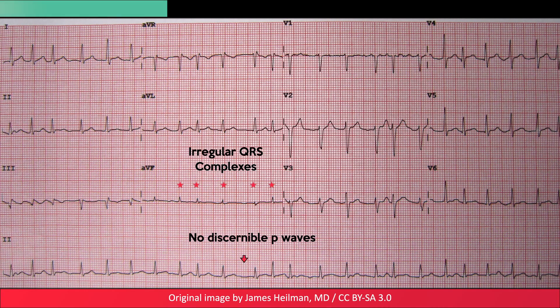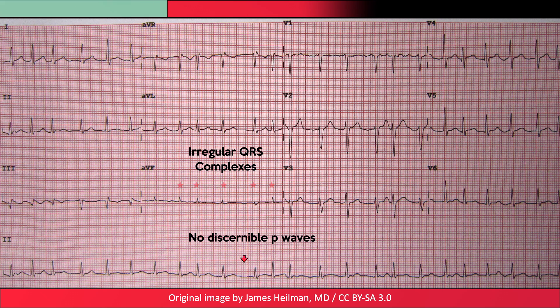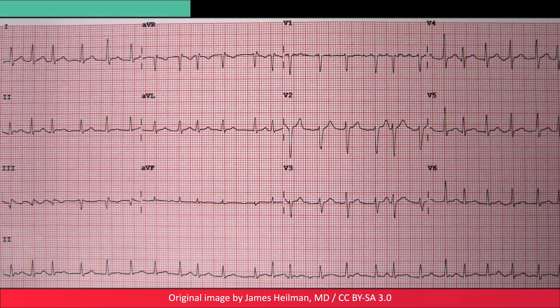When the fibrillatory waves are imperceptible, the underlying rhythm can still be recognized via the irregular RR intervals. With AFib, the RR intervals are generally not of equal duration — as in this ECG, some intervals will be longer while others will be noticeably shorter.